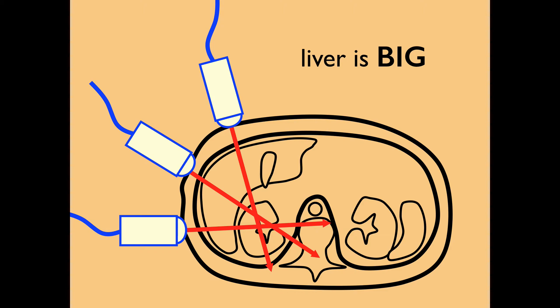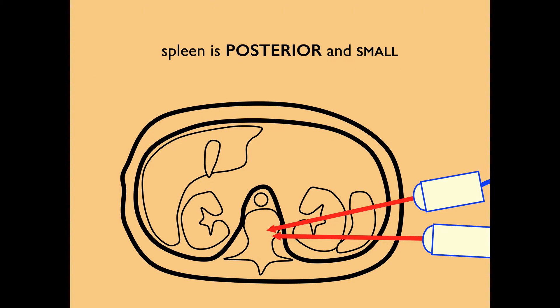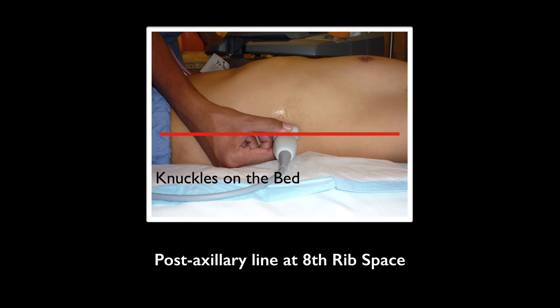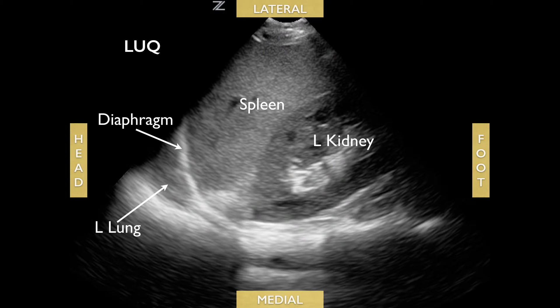The liver is large, so it's fairly easy to see Morrison's pouch on the right side. However, the spleen is fairly small, so for the left upper quadrant make sure your knuckles are on the bed because the spleen is fairly posterior. You'll be at the posterior axillary line around the 8th intercostal space.